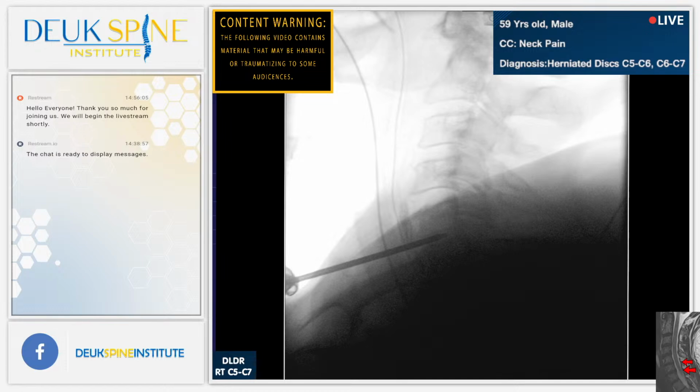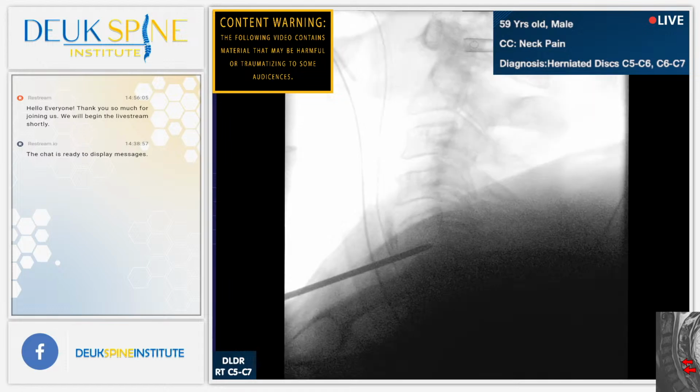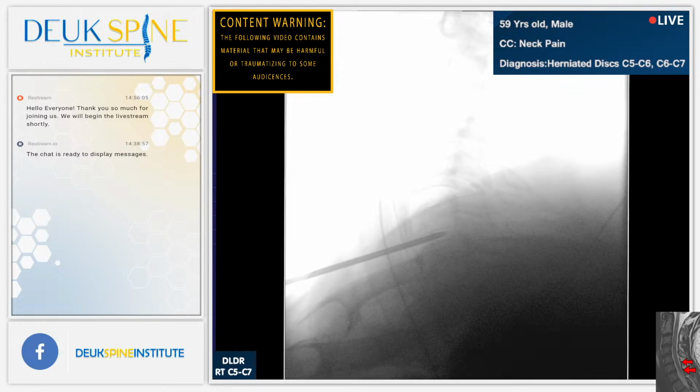Well, let's try a little pipe cleaning, and then let's try another discogram. I want to see if I can get anything past this massive wad of tissue. Shot. Oh, you guys. Yeah, sticky. Shot. Shot. Just can't see anything. All right. Well, we see enough that we can proceed safely.